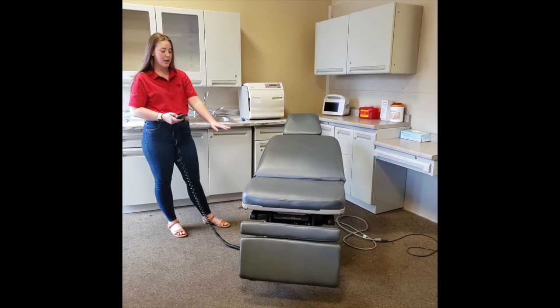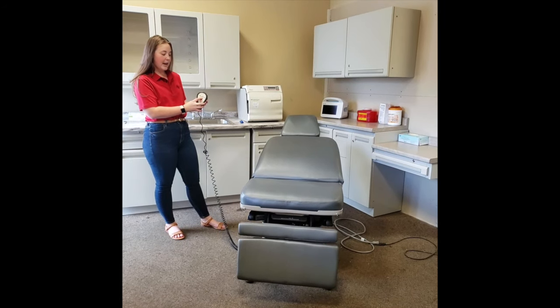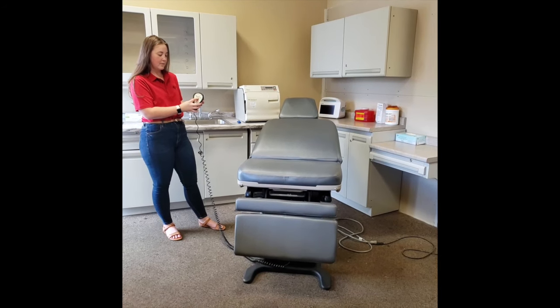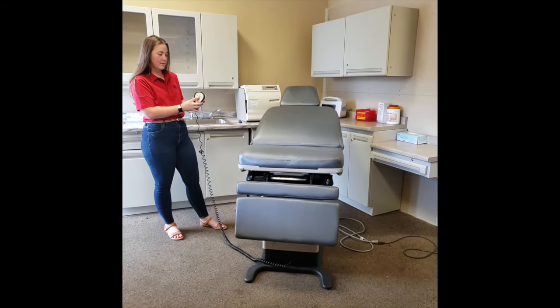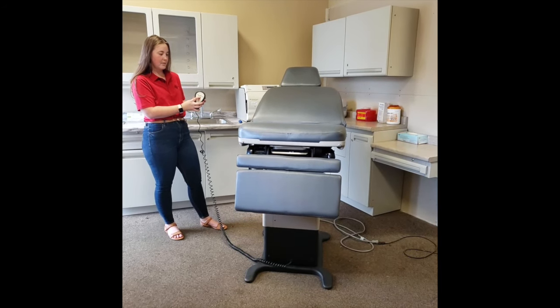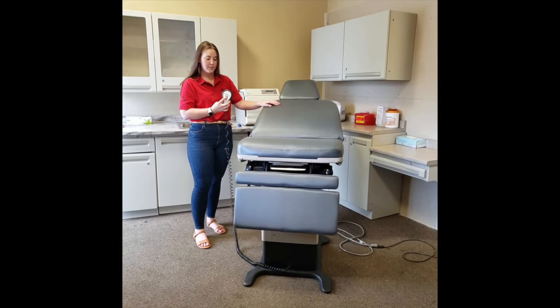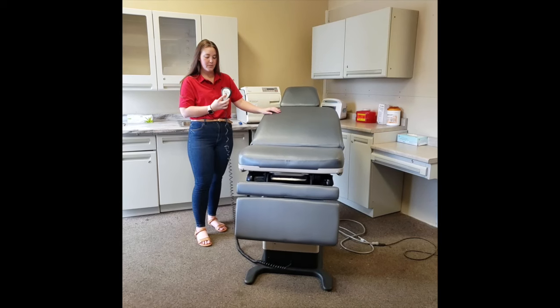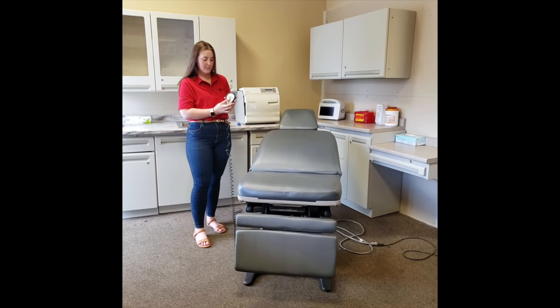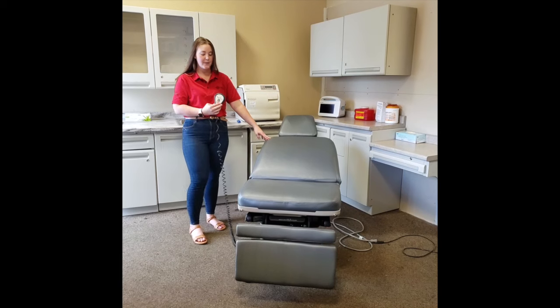To bring the base of the chair up or down, you will come to the middle of your panel and click the arrow up. With the chair fully raised, we can then bring it down.